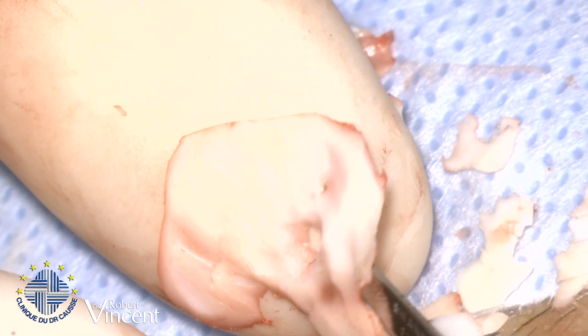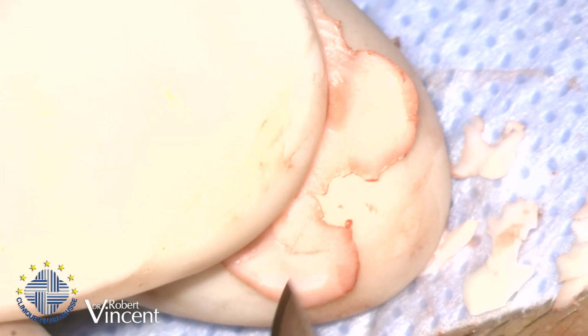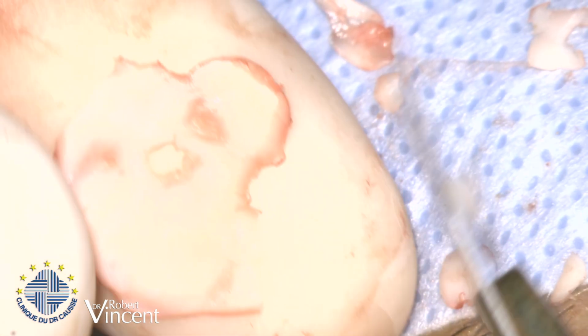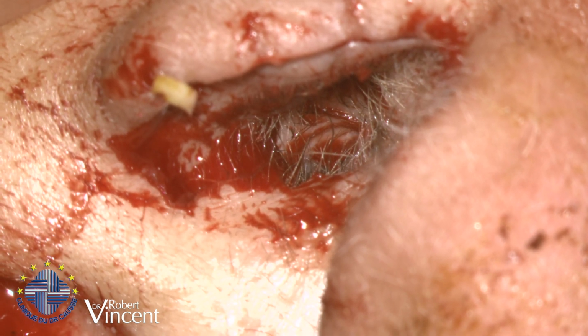Okay, looks good I think now. We have a hole there in the middle, but it's not a problem. It's going to cover the whole thing. Alright, let's see what I can do with this. I will remove this, I think. That would be enough. Okay, we're going to try if I can place it like this. I think it's going to be too large, but we will see. It's better large because you can cut it. Sure, of course.